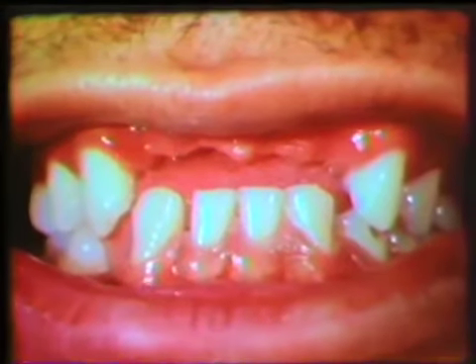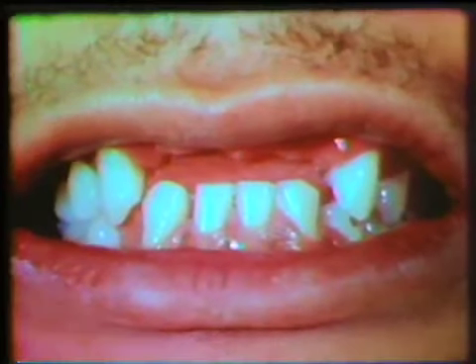An intraoral view of the patient clearly indicates the limited space between the crest of the maxillary anterior ridge and the incisal edges of the lower anterior teeth. It is apparent that the mandibular incisors have extruded due to the lack of contact. The indication for the use of an all-metal base now becomes more obvious.